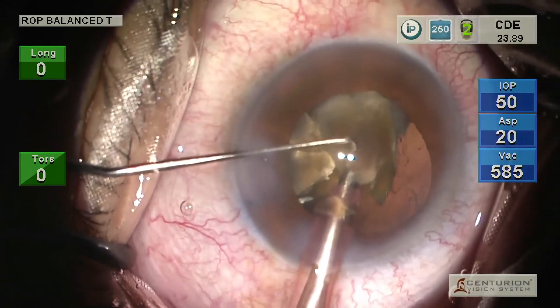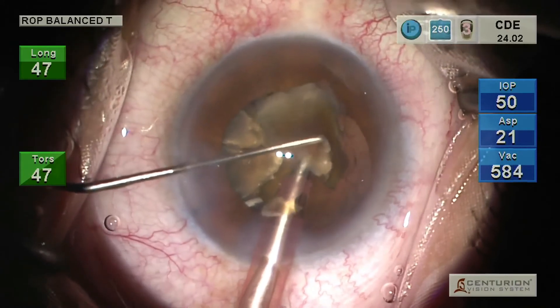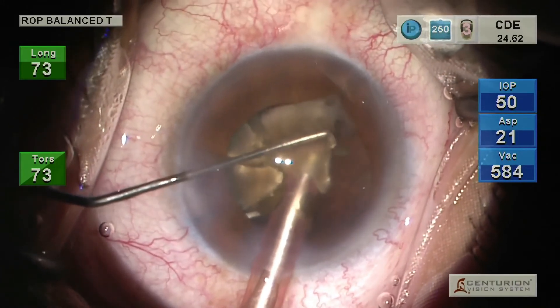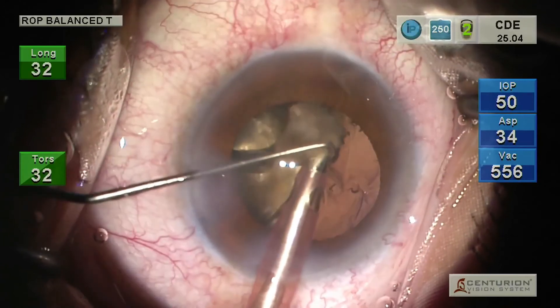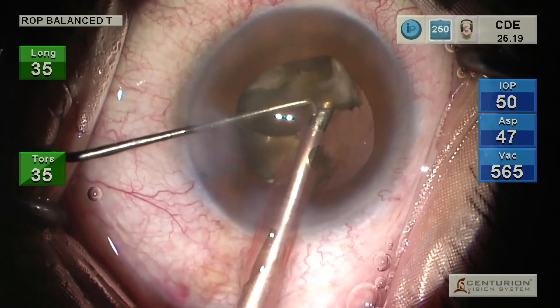We use a thin chopper which does not obscure the vision of the surgical field at any point of time. Our technique involves a simple step which can be easily incorporated by a surgeon for safe phacoemulsification of rock hard cataracts.